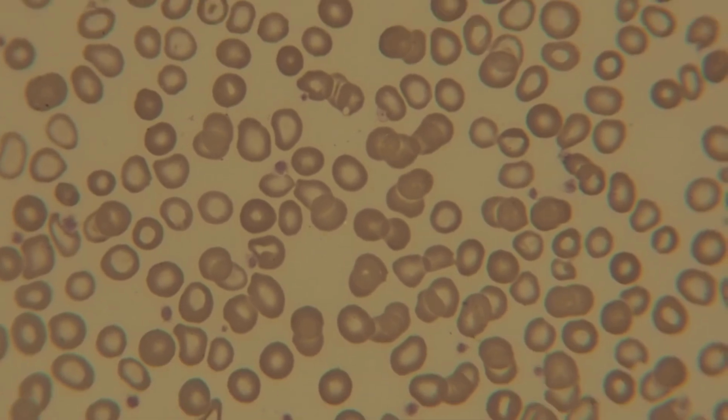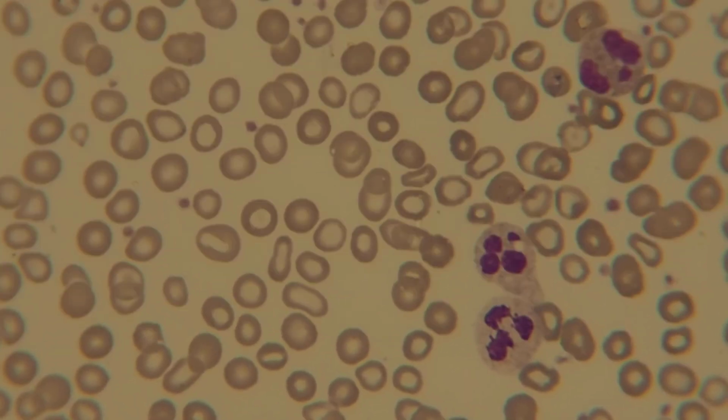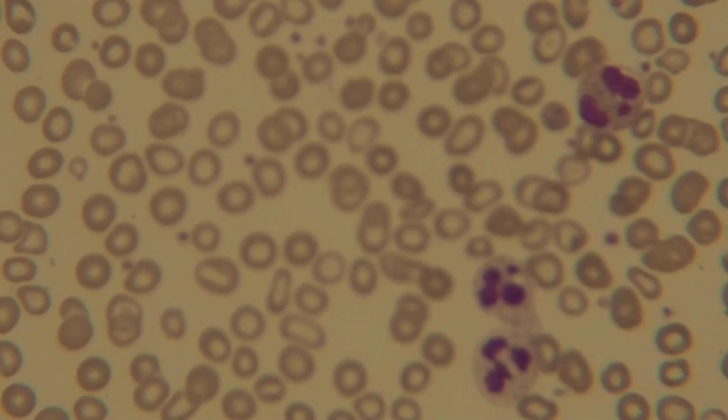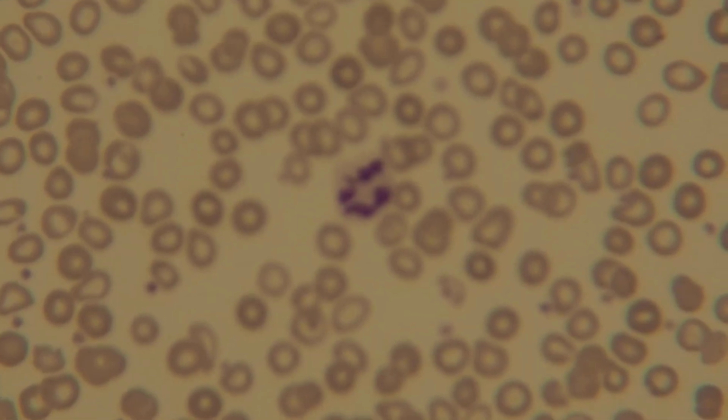You have to be careful not to backtrace because then you're counting the same cells. Neutrophil, neutrophil, neutrophil, eosinophil, neutrophil.